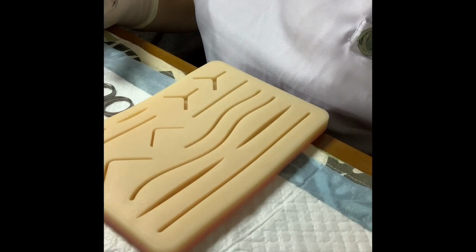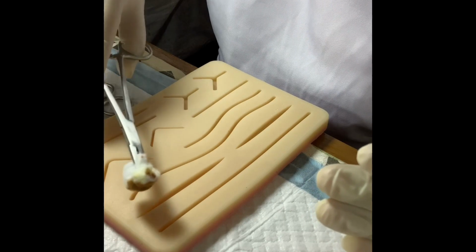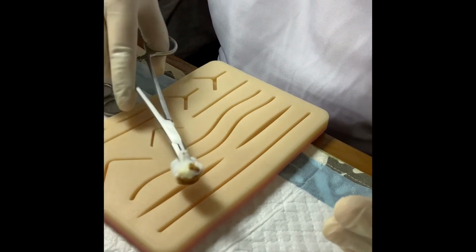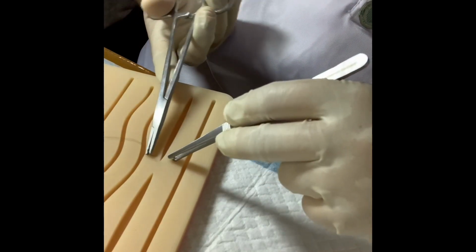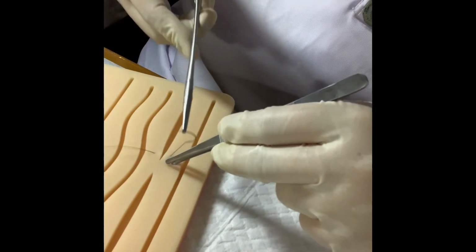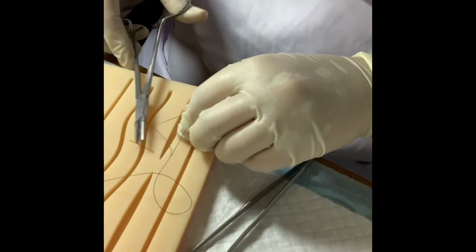The area must be sanitized first, and after putting anesthesia on the wound, clean the wound area using povidone iodine for this demo. Pierce the skin surface with the needle perpendicular to the skin at an appropriate distance at the wound edge. Drive the needle through by rotatory movement of the needle holder, recreating the arc of a circle. If the wound edges are close together, you can drive the needle across both sides of the wound.